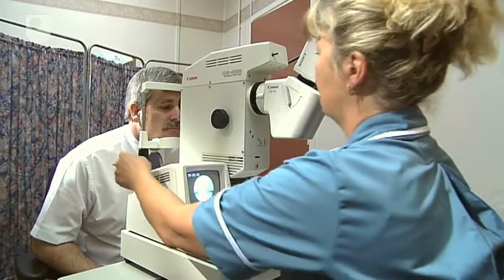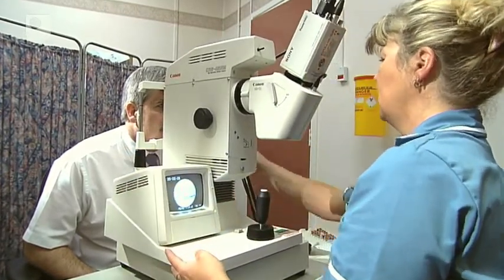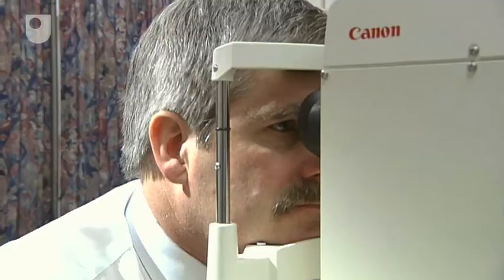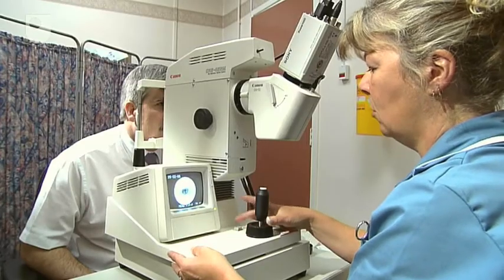Just need to get in for, so hold that a second. Put that over that eye and then you'll be able to focus in the camera better.